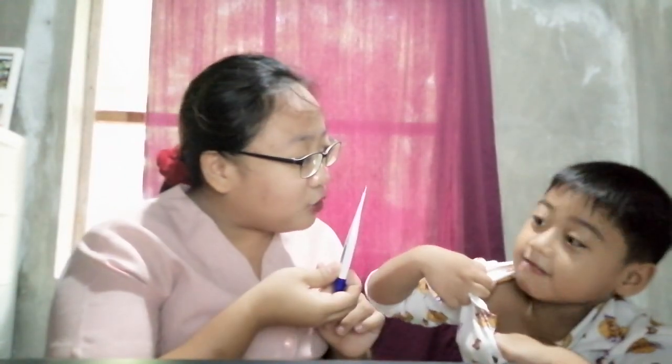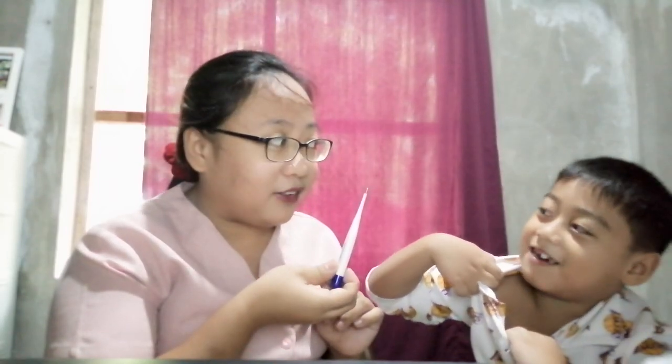Next, inform the client that you're going to take his temperature under the armpit. Gab, where is your armpit? So we inform the client: Gab, I will get your temperature in your armpit. Next, place the thermometer under your client's armpit.